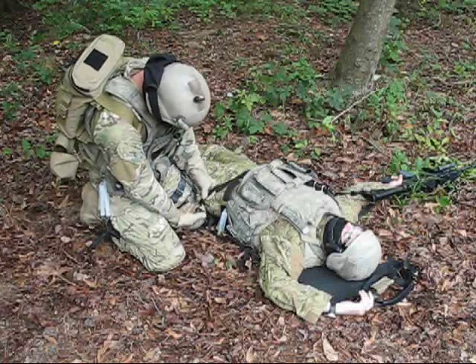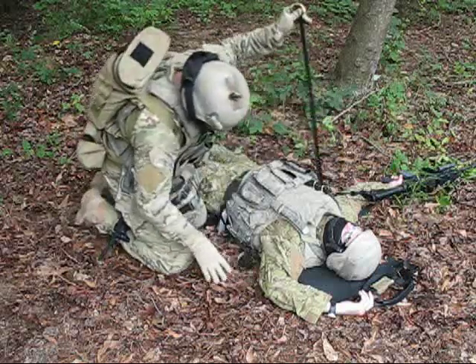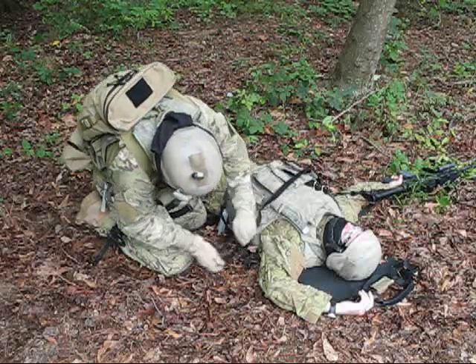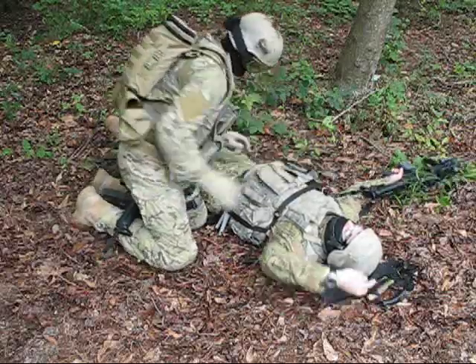To secure a conscious casualty, route the waist strap. The casualty's hands are now free to maintain control of his weapon.